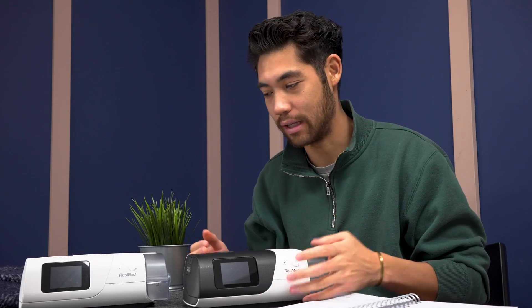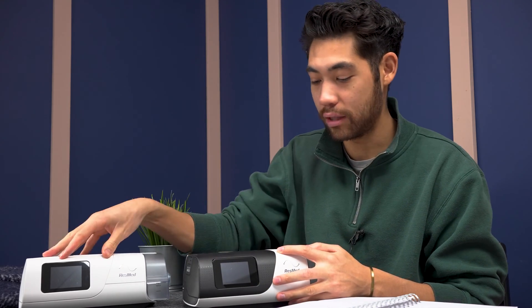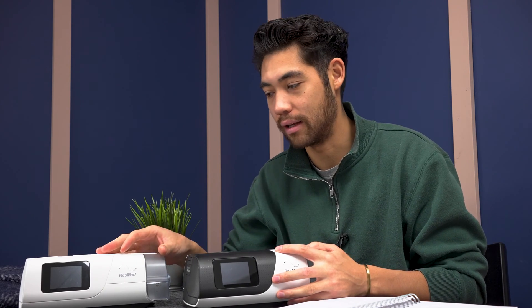Hi everyone, my name is Tristan from cpapstore.ca. Today we're going to be looking at the ResMed AirCurve 11. It looks very similar to the ResMed AirSense 11, other than it being a white top versus a black top, but this is an AirCurve device, meaning it is a bi-level or BPAP device. We're going to talk about the slight differences between this and the old one, as well as the differences between these two machines, and look at the settings.